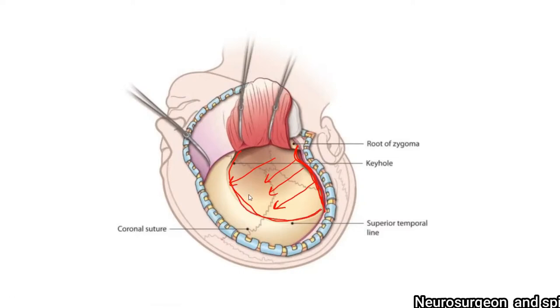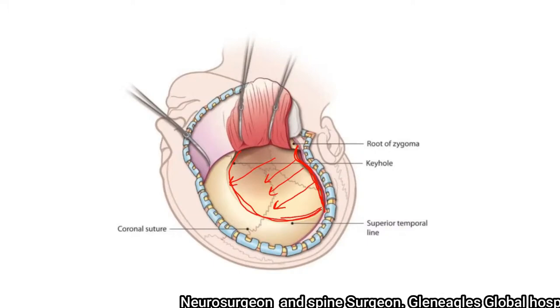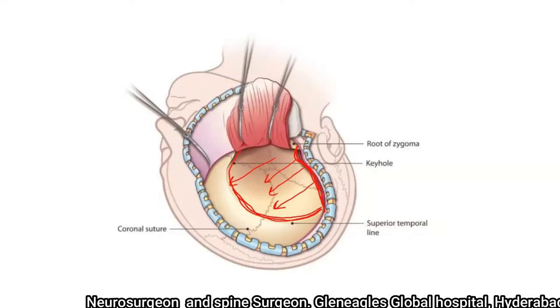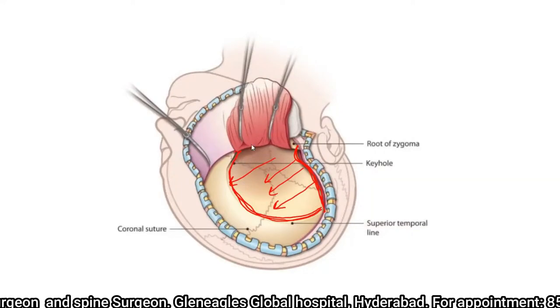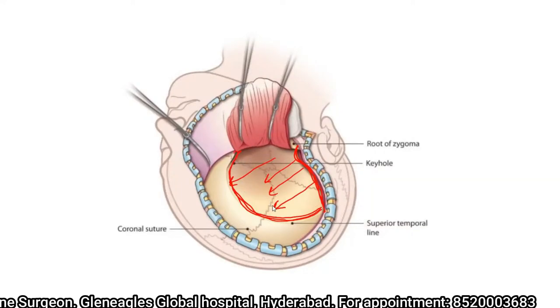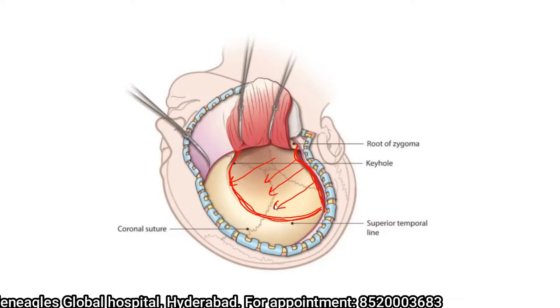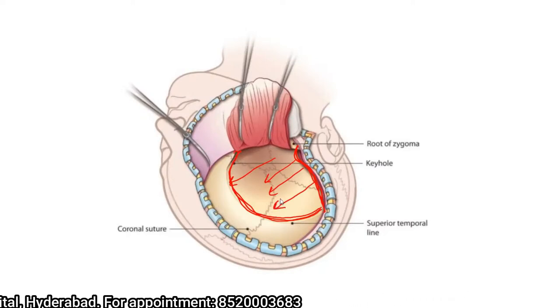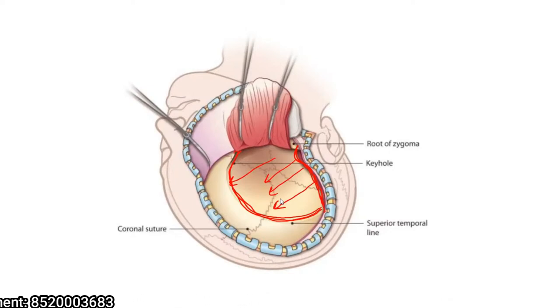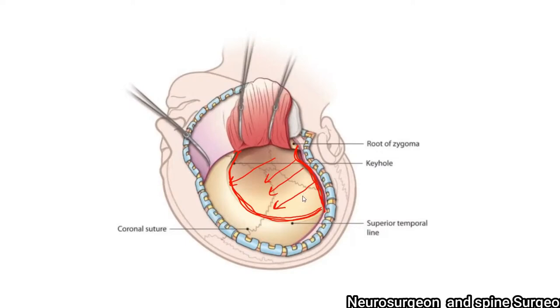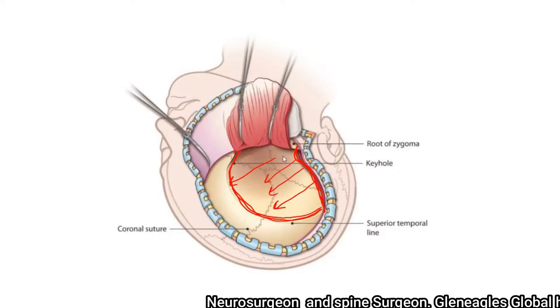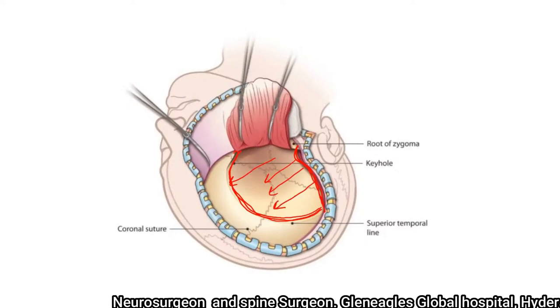When you come to the attachment of the temporalis muscle, you can use the same periosteal elevator to detach it. You can leave a small cuff of the muscle attached along the line, which will help at a later stage to suture the muscle back. However, because this is a decompressive craniectomy and you are not planning to replace the bone flap, this precaution is not required. The temporalis muscle is then reflected backward.